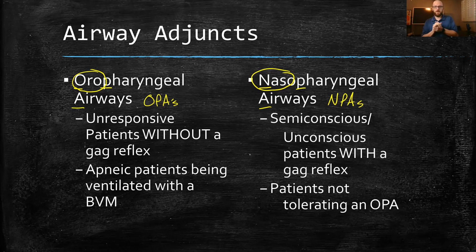Cool. So OPAs, NPAs, measurement: corner of the mouth to the earlobe, or tip of the nose to the earlobe. And remember that any sort of head or face trauma is a contraindication for the nasopharyngeal airways, the NPAs.